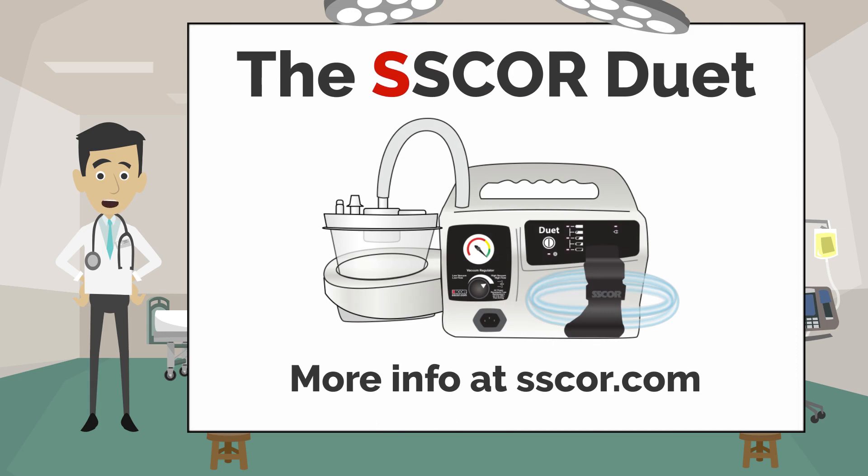The SSCOR Duet. Find more information at sscor.com SSCOR Duet.